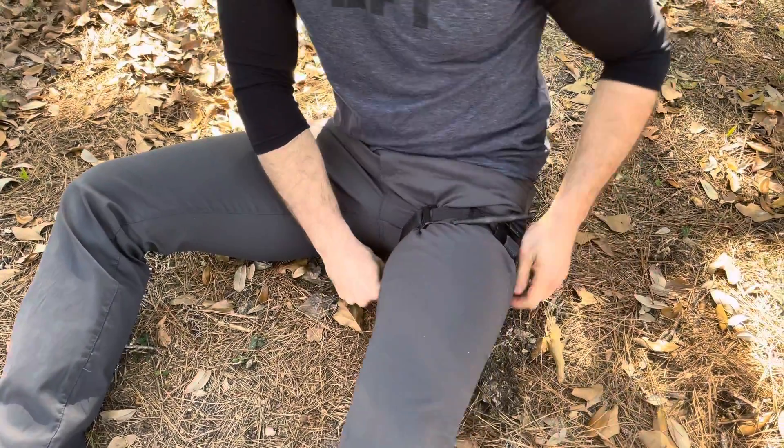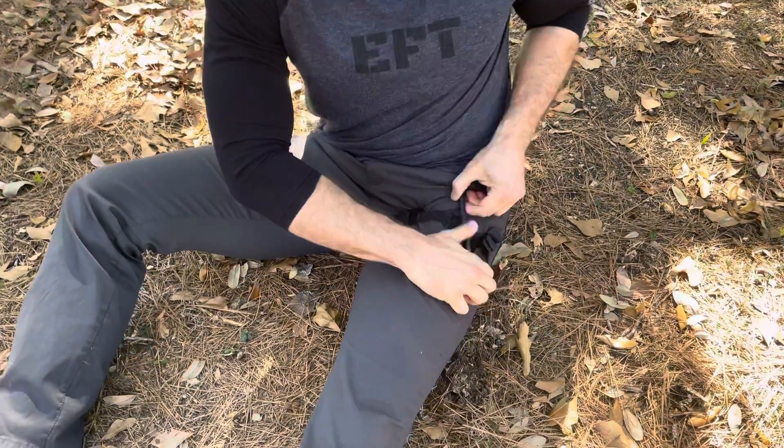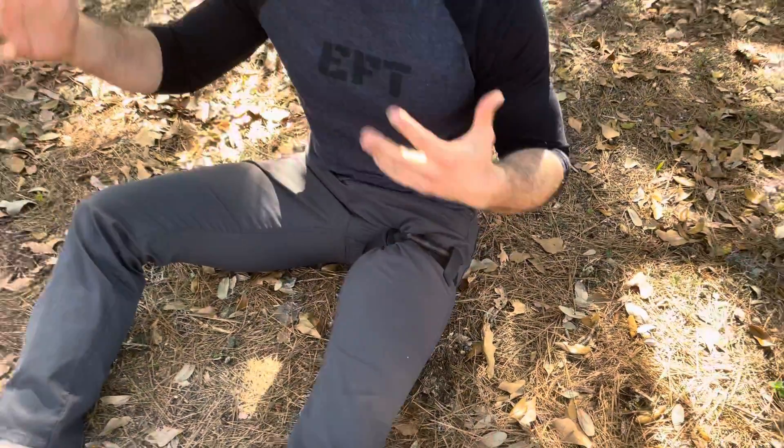Make sure the strap goes all the way around as tight as you can possibly make it. Spin the windlass and secure it into the windlass catch. Secure it, and now you have the opportunity to move to additional cover.